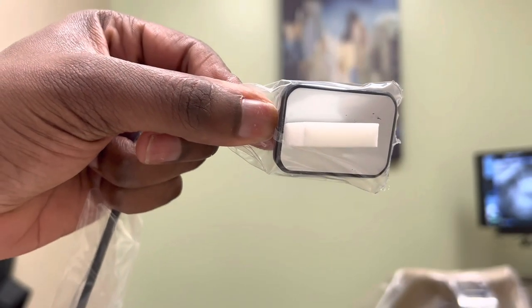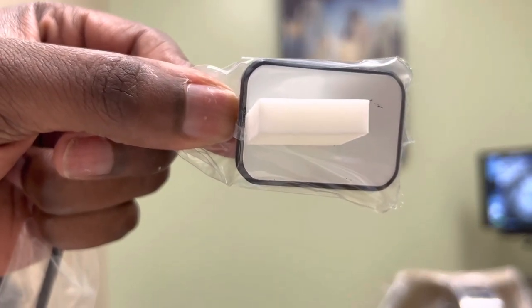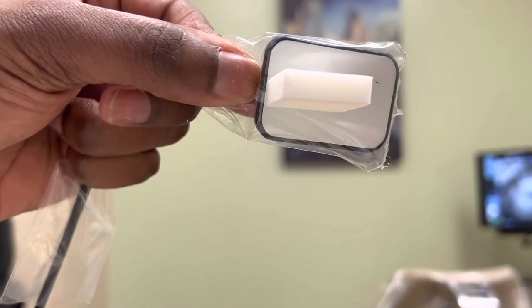This shows a closer view of what the setup should look like. As you can see, the tab is right on the very edge of the sensor on the side where the cord is.